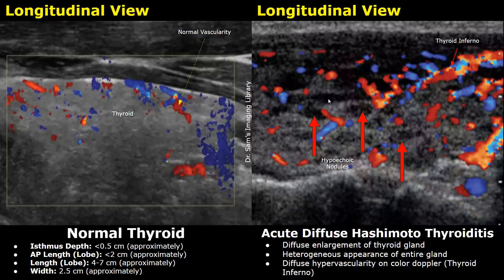This is another case showing hypervascularity, or thyroid inferno, in a case of Hashimoto thyroiditis. You can also see hypoechoic nodules and the gland appears enlarged.